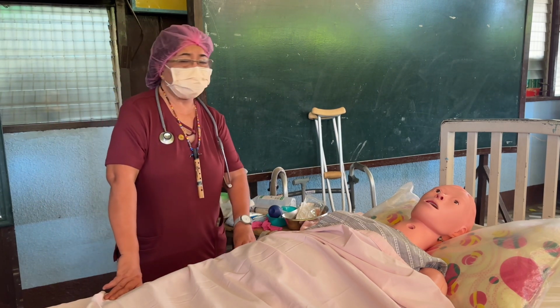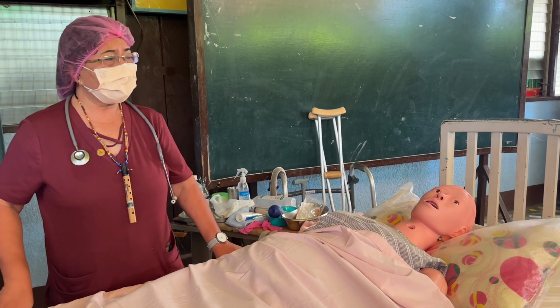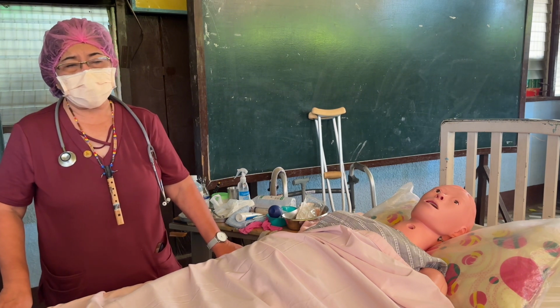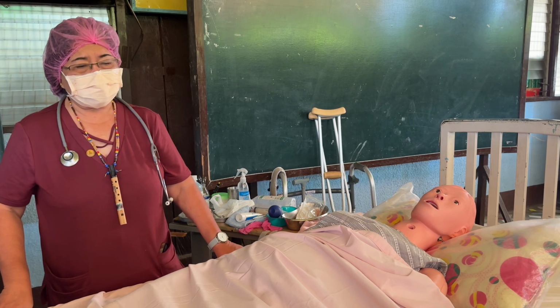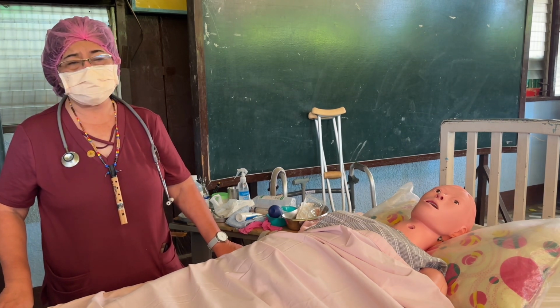Now I'm going to do the sequence. Read the chart. We have to know the case of the patient's data, the indication why the NG tube is being inserted, the diagnosis, the doctor's order, and any precautions that you should observe.